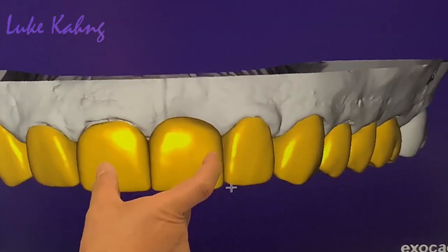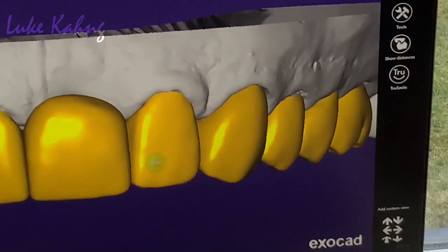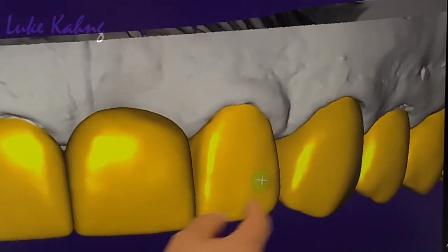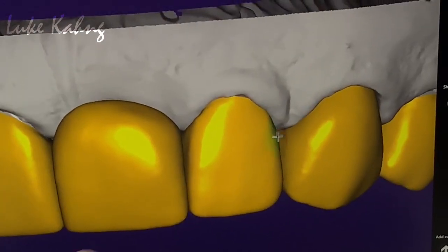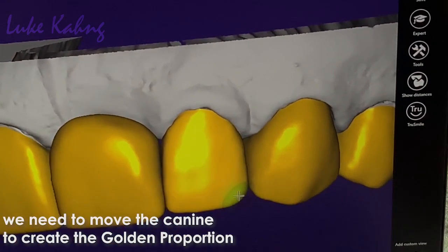So then, 100%, 70%, 50 to 60%. A little bit more. Okay, easy. I don't mind. You can go to that direction a little bit more. Yeah, because I'm trying to make golden proportion. That's why move it. Canine, move it.